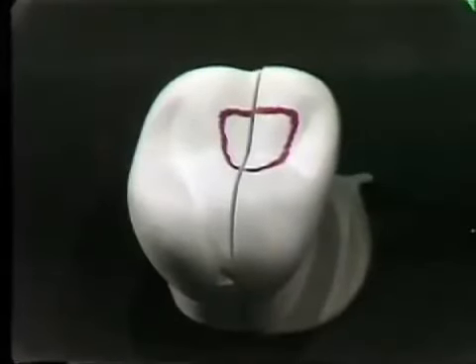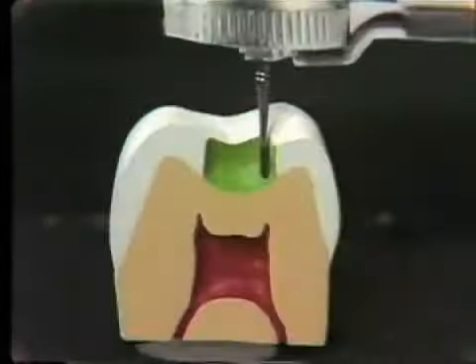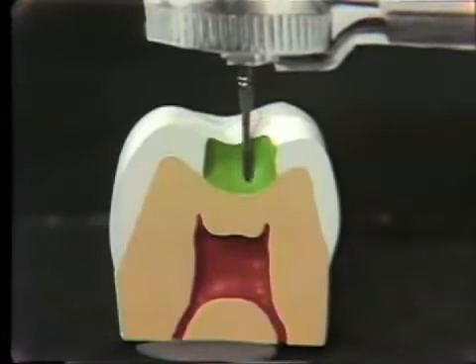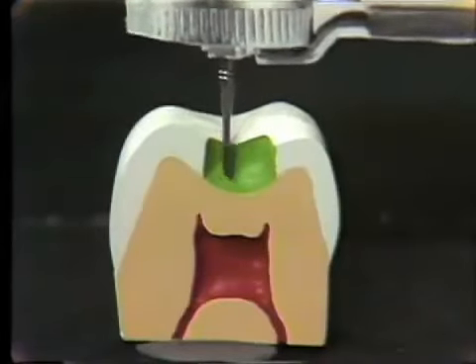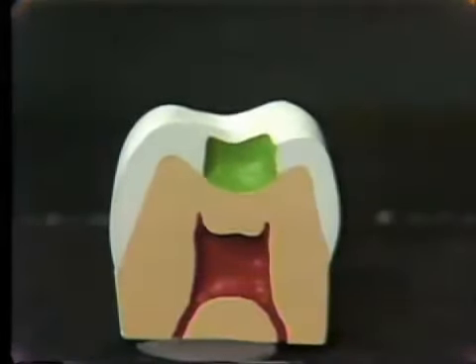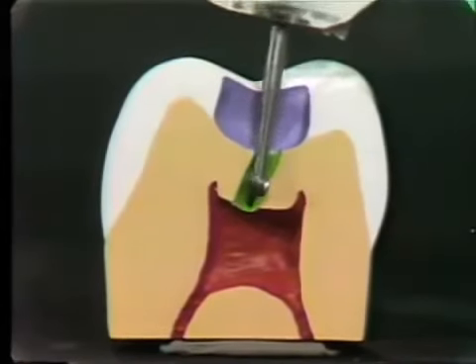Here's the maxillary molar with the pulp as we visualized it. Part of the tooth that's bounded by the mesial buccal, the distal buccal, and the mesial lingual cusp forms a triangular outline form right in the middle of that area. Once again, we establish that tentative outline form with a 1057 high speed, penetrating right down to the dentin. When we reach dentin, we stop, switch over to the number 6 low speed round burr, and penetrate into the pulp.